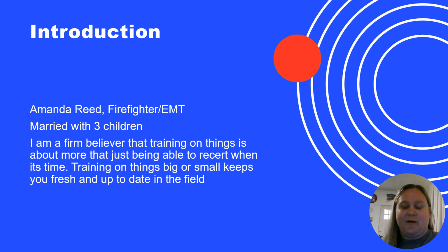I'm doing this AED refresher. Some may think it's silly, but I'm a firm believer that training on things is about more than being able to recertify when it's time for your certification. I feel the training on things, whether they be big or small, keeps you fresh and up to date in the field. And I feel that the AED is one that a lot of us rely on the fact that it has pictures or it talks to you. So with that being said, that's why I've decided to do an AED refresher.